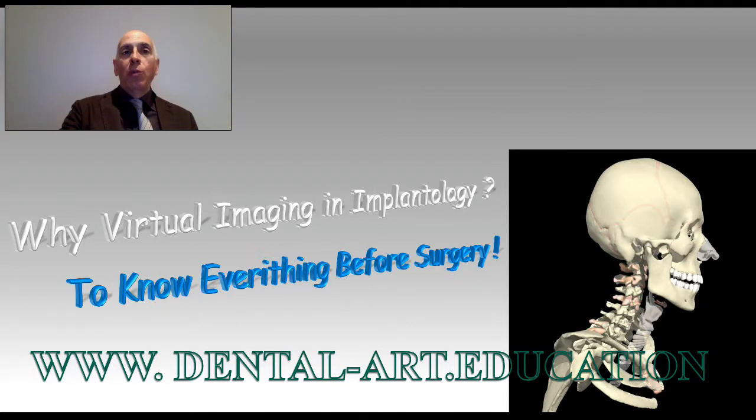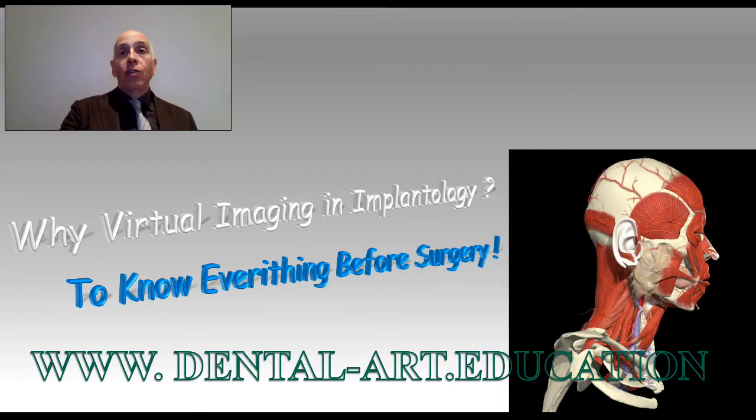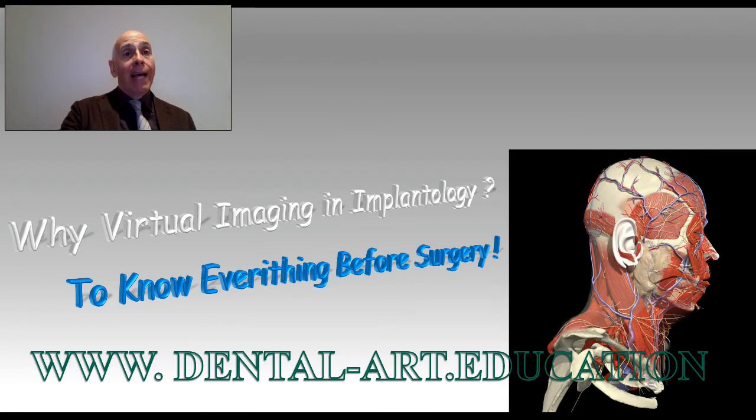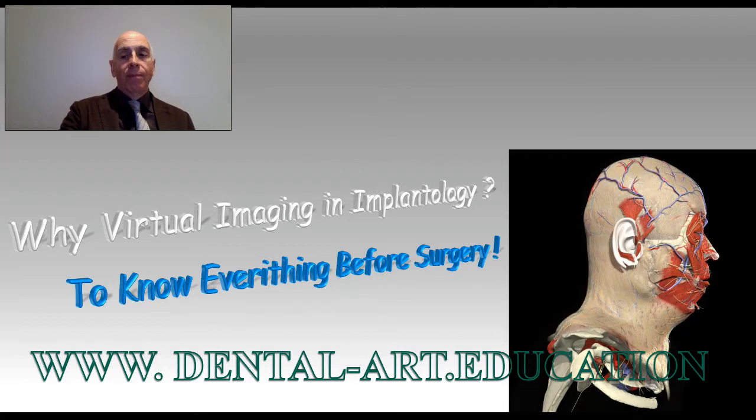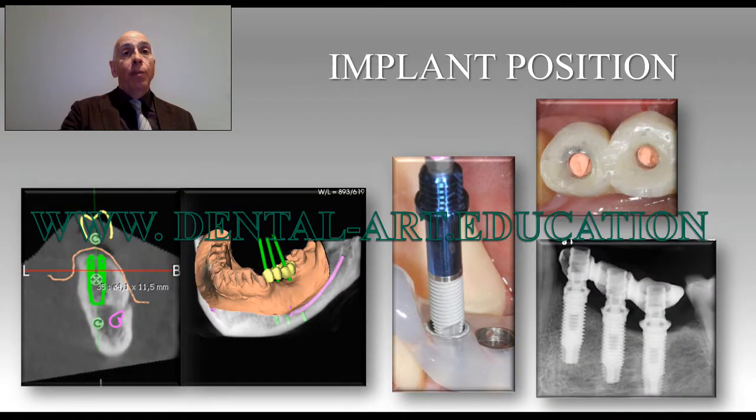Which is the reason why we should use 3D computer-assisted technology in dentistry? The most important benefit we can get from a 3D reconstruction is the chance to get to know every aspect of the patient's anatomy, both hard and soft tissue, before operating. Once we know the anatomy, we can plan the appropriate implant position in relationship with the bone of the patient and the prosthetic design.